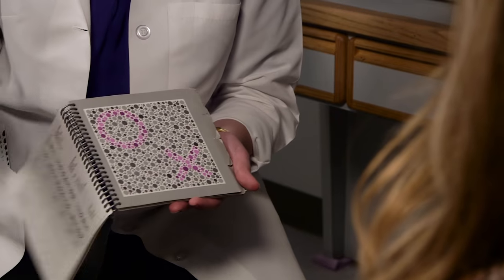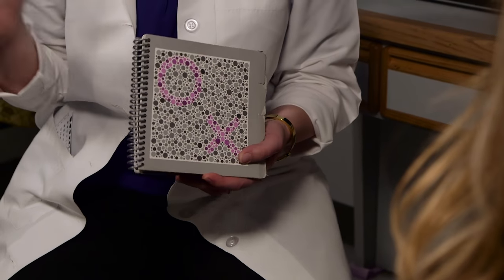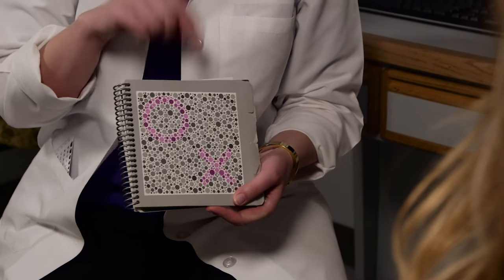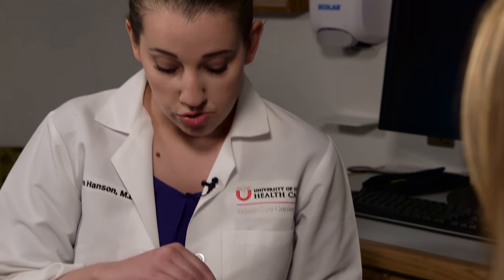Generally you want to examine patients who have an acuity of around 20/200 or so. The test starts out with four different control plates, and you want to have the patient test one eye at a time.